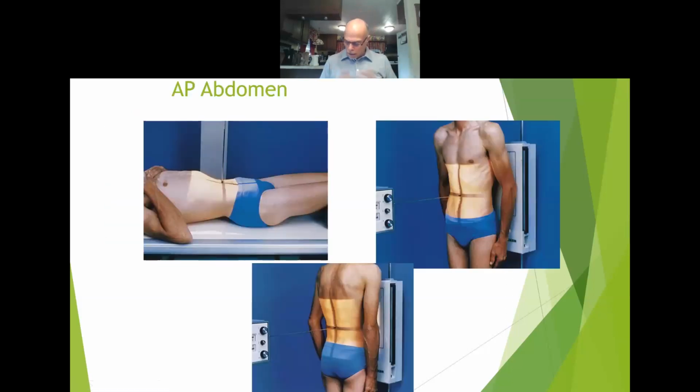So here on page 137 are these images, and we're just going to talk a little bit going back to your book. I'm in the middle column. It says ensure that the weight of the patient is equally distributed when you're doing them supine. Place the arms so they do not cast any shadows. If the patient is supine, as in this picture here, you can see their legs right underneath the knee. There's a sponge that helps relieve the strain off of the lower back, which helps to relax the abdominal muscles and the organs and all. So that's a good thing. I always do it. Make sure you support something underneath the knees.